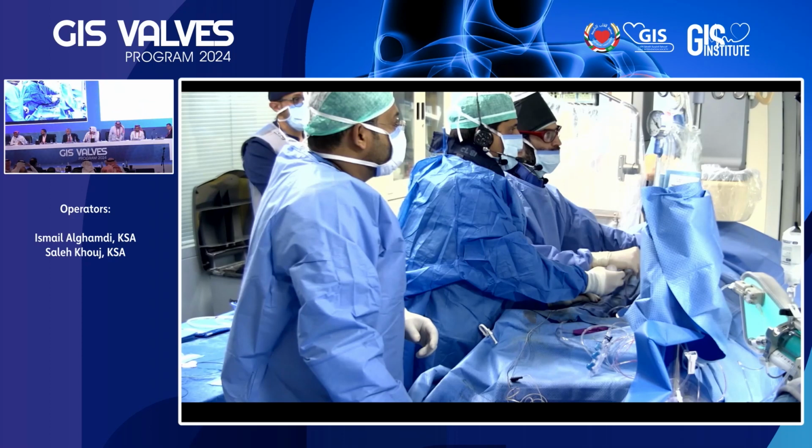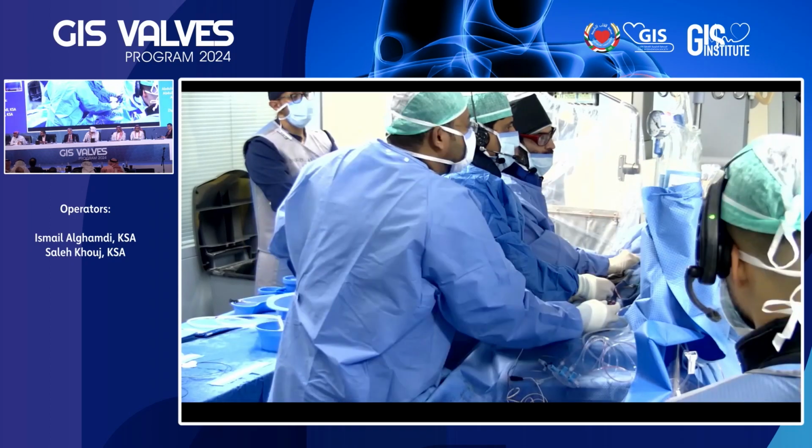So if you take the alignment of the calcium and the bicuspid and the LVOT, probably you go either same size or slightly undersize the valve to avoid the unfolding, the folding of the valve. If it is bigger than the bulging from the raphe, calcified raphe, it will be stayed, calcified, folded, and may interfere with the hemodynamics. So pre-dilate? I do recommend it in this case.